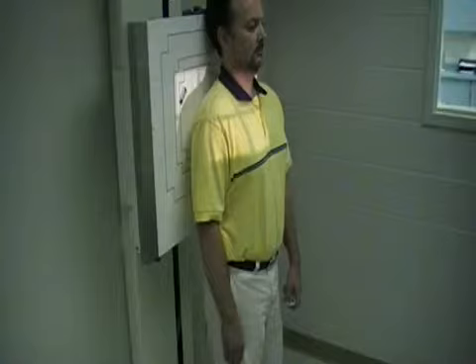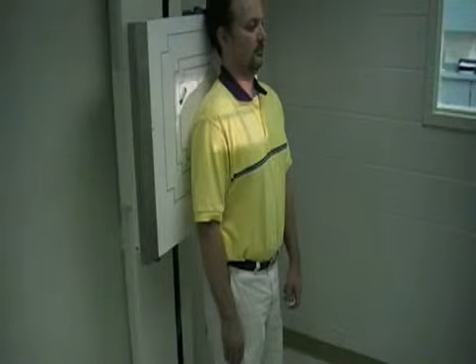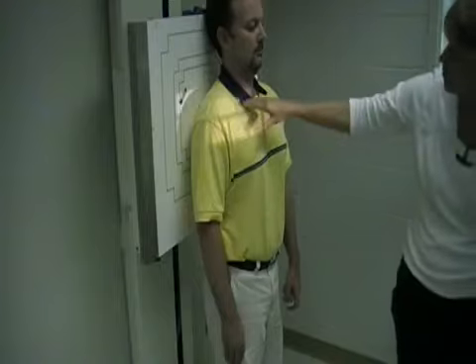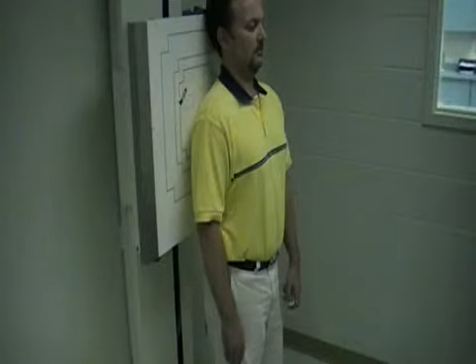So with this projection, I can collimate from top to bottom, because we do not need very much of the chest in. We just need this clavicular area. Okay, so that is our AP clavicle.